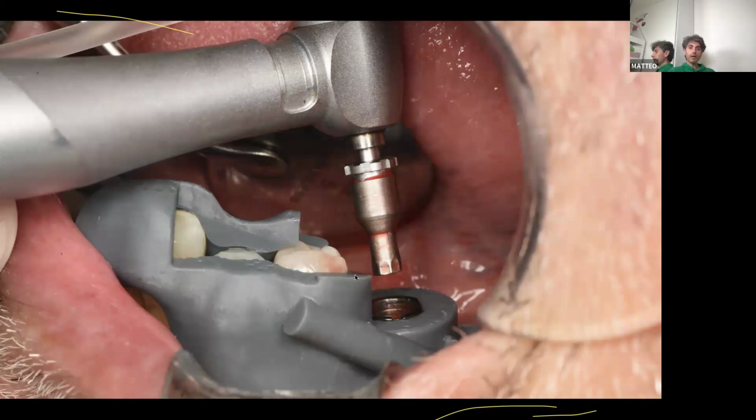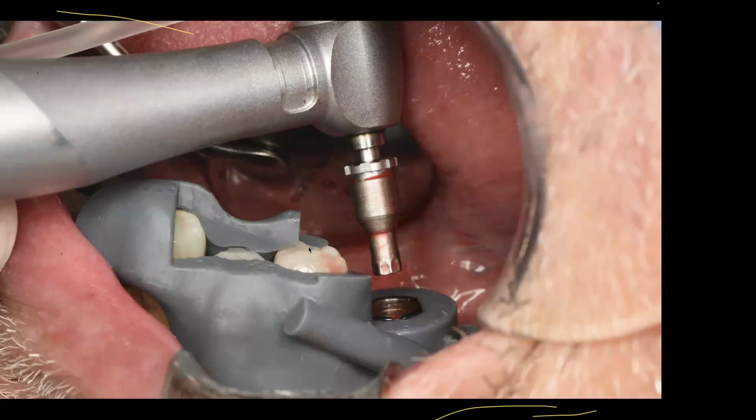Another thing is that sometimes you have to remove part of the material of the guide, because if not, you don't have space for anything. Sometimes you even need to remove part of the surgical guide, as here, in the area of the distal part of the abutment tooth, because otherwise it was inconvenient to get into this zone.